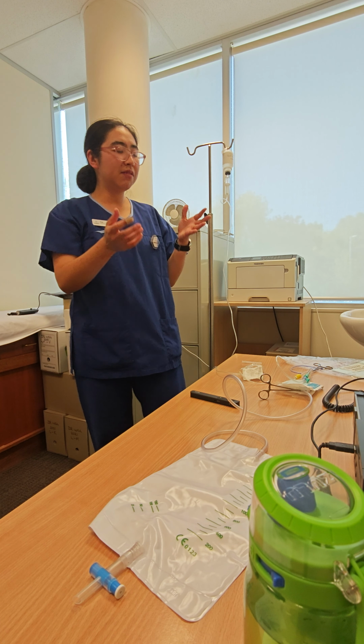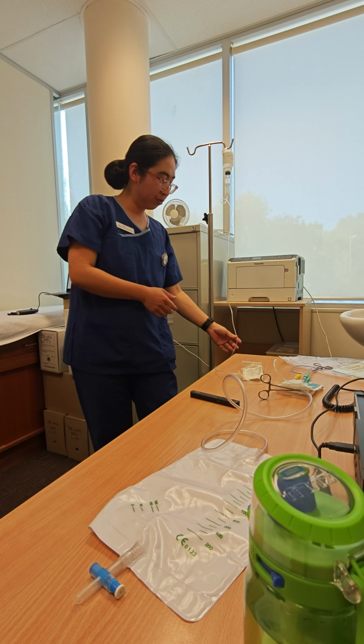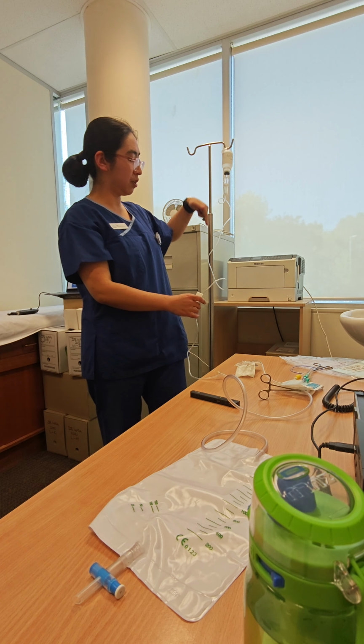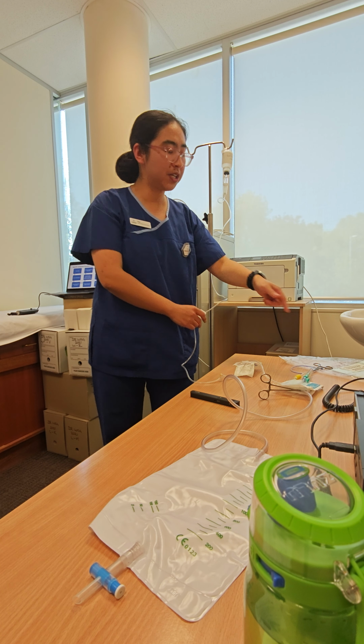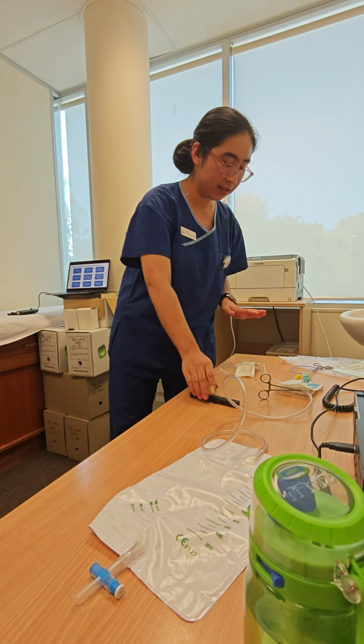So when the doctor comes, if they want to start, they're gonna unclip the clamp and just go through that bottom up. The contrast is gonna go into the patient's body, into the bladder straight away. All right, it's all connected, all good.